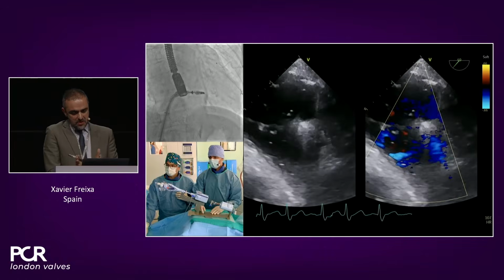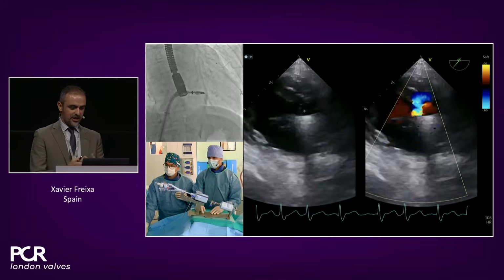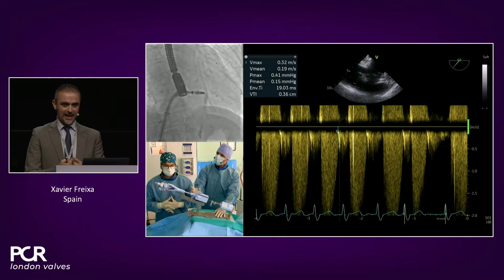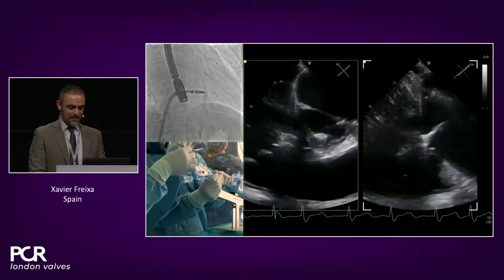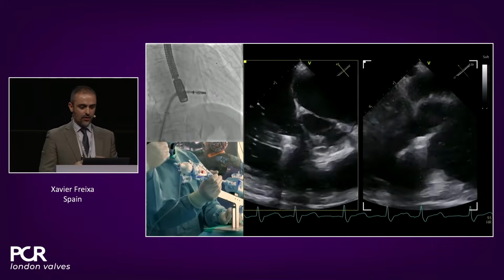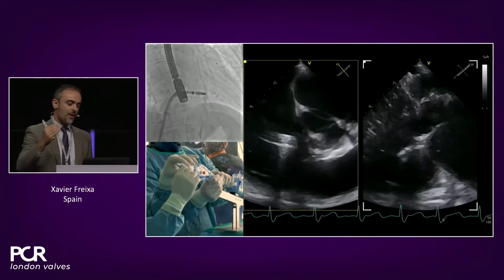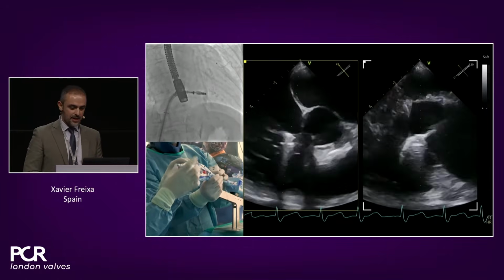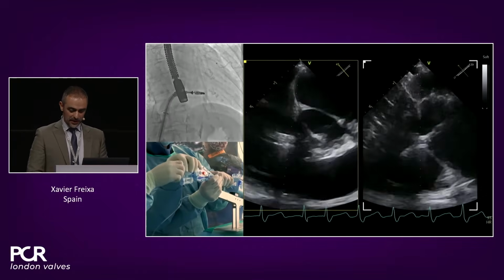So it's true that maybe you can push it a little bit more central, but I think it's what we wanted. And now you can appreciate here that there is still a gap. Maybe not that much color, but still a gap. So as Stefan, Marta, and Philip said, it's really important in those cases to not stay so focused on the color, but to try to restore from the anatomical perspective. And don't forget, from where we come, that it was a large gap. Remember, 10 millimeter, 11 millimeter gap. So it's something that probably we will need to treat.